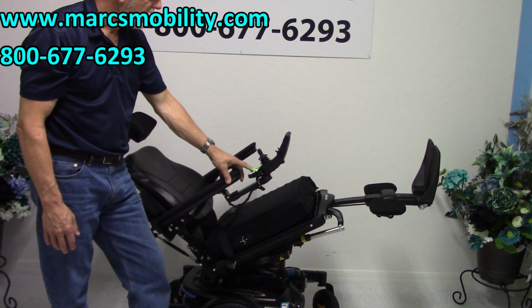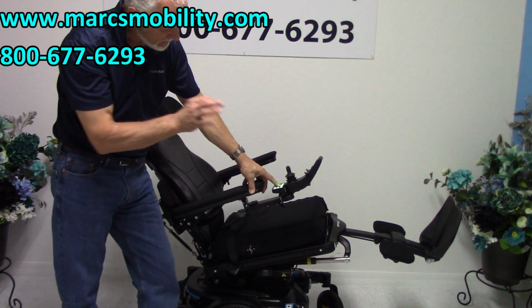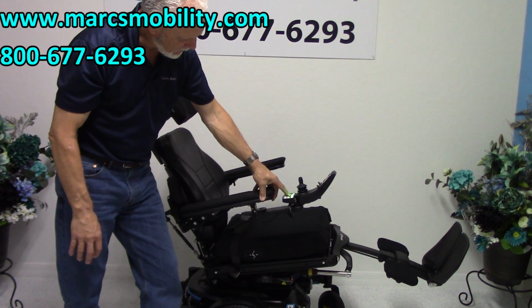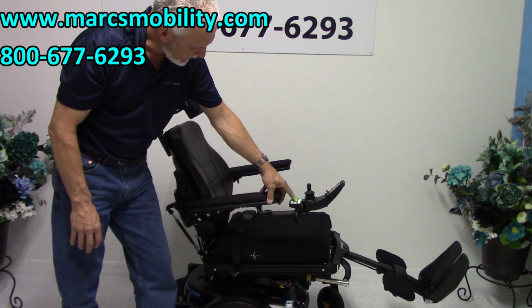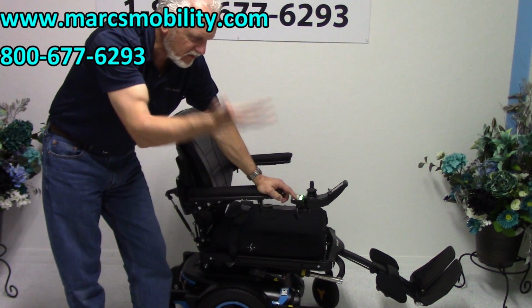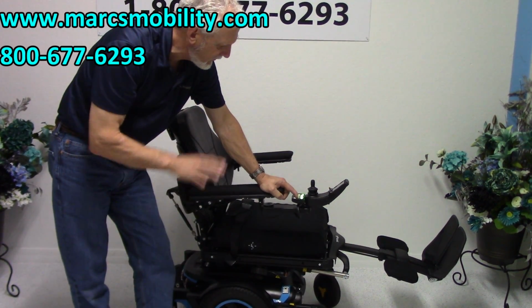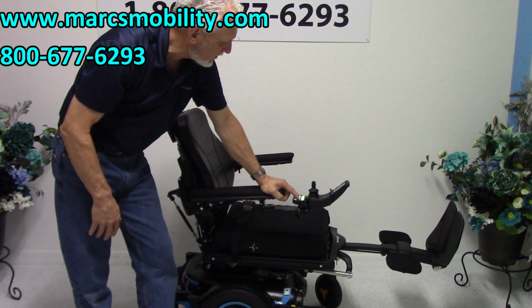So far we've covered the electric tilt, the electric legs, and I'm going to bring the legs all the way up so you can see how far up they go. It's better to bring the legs all the way up before you do your tilting if you're going to do your circulation, because they seem to go up higher if you start this way and then you tilt afterward.